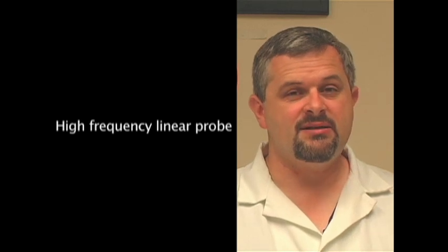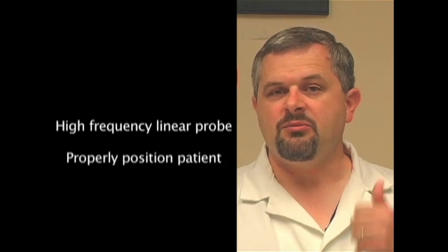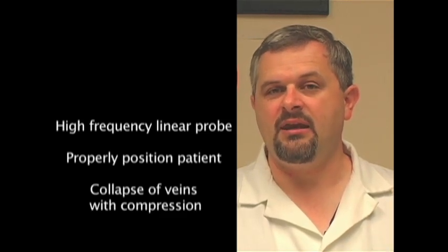With practice, emergency physicians can perform ultrasound for DVT with proficiency, accuracy, and timeliness. The keys to this are to use the high-frequency transducer, to properly position the patient, and to ensure the complete collapse of the veins at the key 3 segments of the leg.